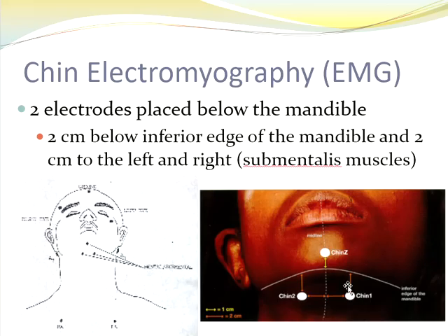So again, chin 1 to chin Z usually provides the primary signal, but say one of these were to fall off, instead of having to go in and wake up the patient, we just re-reference what we're looking at on the computer screen to the 2 electrodes that are still working well. The chin electrodes are one of those that you can deviate where you apply them based on the patient's anatomy. So if you have somebody with facial hair, typically you'll find facial hair gets a little lighter right underneath the corners of the mouth.